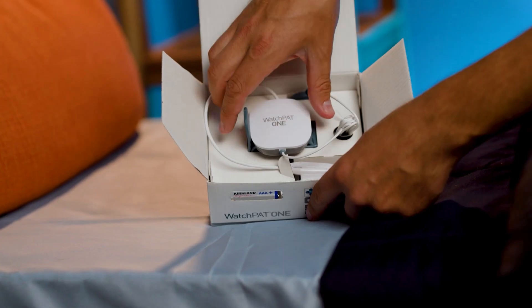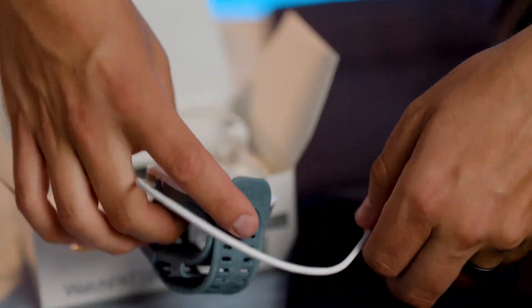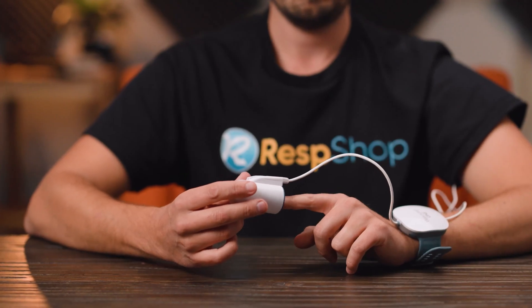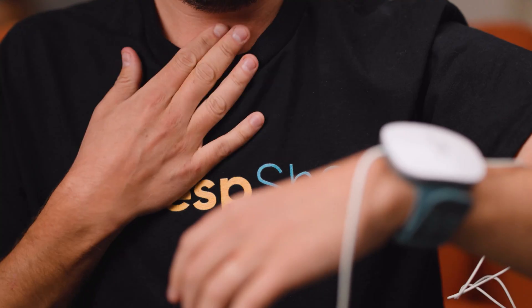For example, our favorite at-home sleep kit, the WatchPAT1, contains a watch to wear around your wrist, a probe for your finger, and a sensor to stick to your upper chest — and that's it.